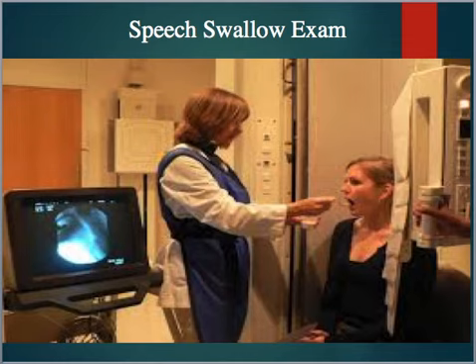This is an image of a speech swallow study. I told you guys earlier, when you do a speech swallow, you're working with a speech pathologist. A lot of times they're trying to determine what types of food the patient can eat, whether it be thick or thin, or if they have to tilt their head a certain way when they eat. Someone is controlling the fluoroscopy machine, and we can watch it live here. We feed the patient different consistencies. It can be a drink, or sometimes we put barium on peaches or graham crackers or cottage cheese, things like that. We have the patient eat it and we watch them eat. You can see them chew and swallow.